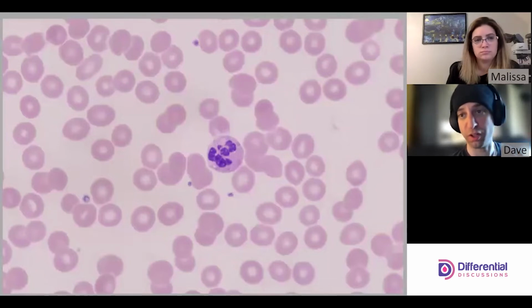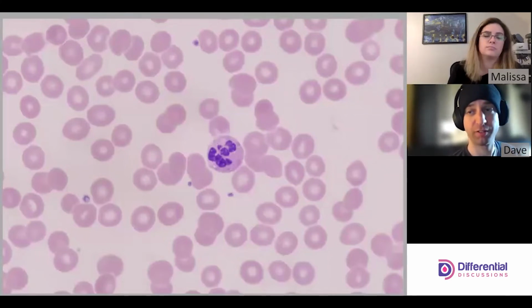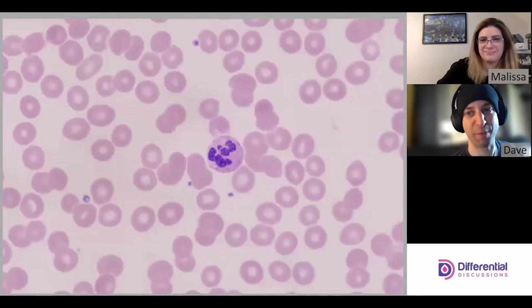On your own, you can go and look at the metabolic processes involved there. But essentially, we have problems with DNA synthesis. Leading from the problems in DNA synthesis, we have red cells that don't divide as often as a consequence, and so they stay rather large relative to a normal red cell. And then we also have a phenomenon with the granulocytes. And so we have a nice neutrophil here in the picture displaying hypersegmentation.